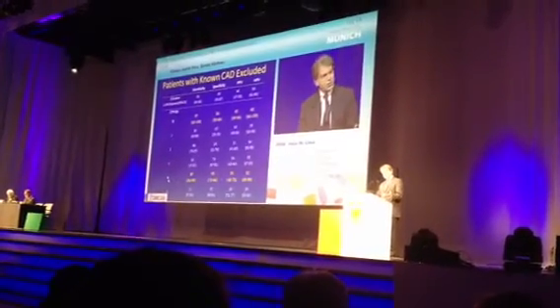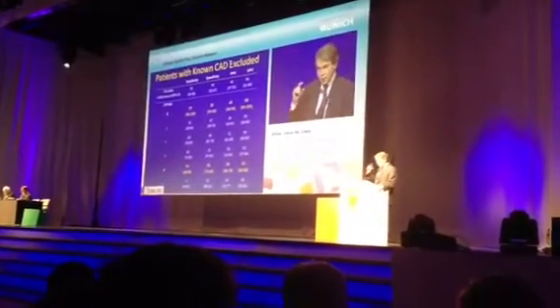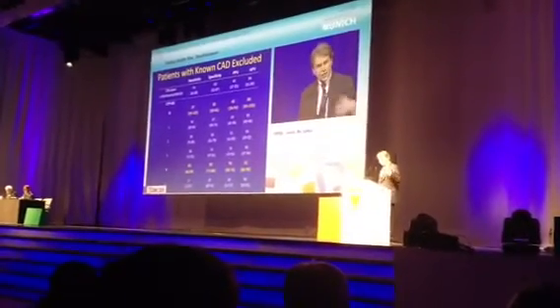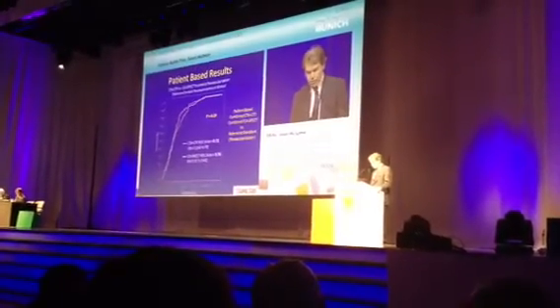If you use a sum stress score of 4, and you still have a negative predicted value of 92 of excluding a flow-limiting stenosis. I like to highlight flow-limiting because this is not only an anatomic measure, it's the anatomy corresponding to a perfusion defect.